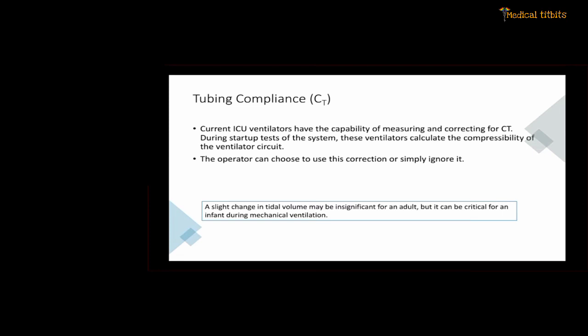if you are doing ventilation on an adult patient. A slight change in tidal volume may be insignificant for an adult, but it can be critical for an infant during mechanical ventilation. In such cases, we need to take into account tubing compliance as well.